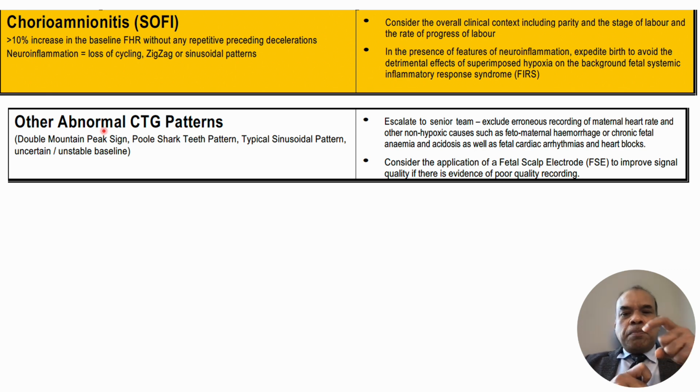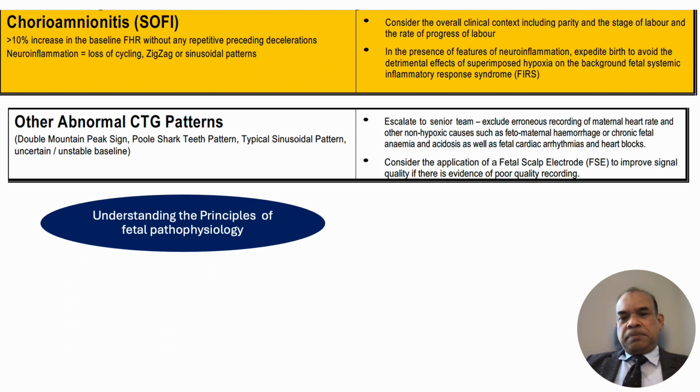There will be large amplitude accelerations coinciding with the peak of the contractions, giving the appearance of one mountain above the other mountain, the double mountain peak sign. And also we have the shark teeth pattern, sinusoidal patterns, etc.